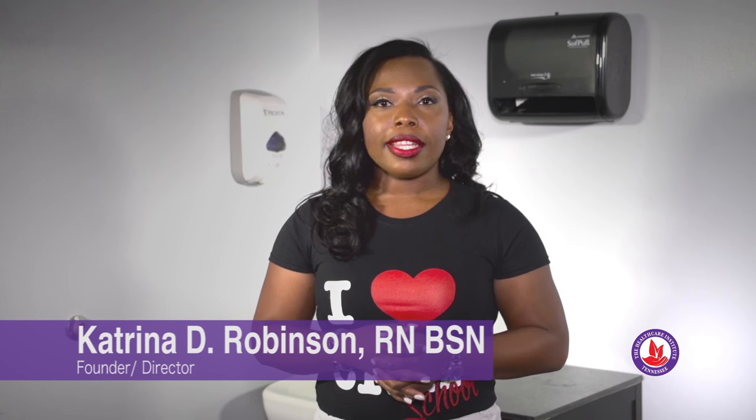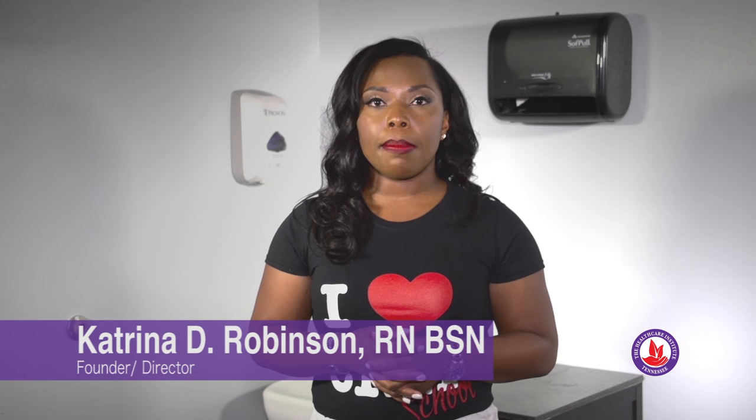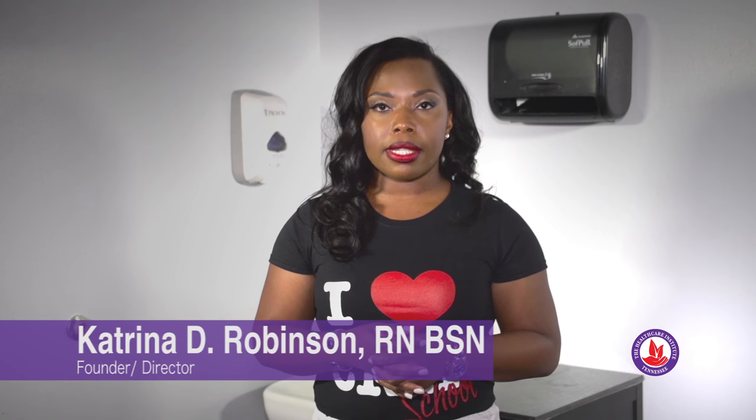This skill is catheter care. This is one of two skills you'll be performing on a mannequin for your state certification exam. The purpose of catheter care is to provide basic care to a resident who has a catheter in order to prevent them from having an infection.